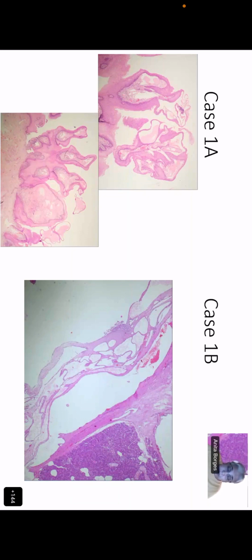So number one, a description is not about only what you see, and there are many irrelevant things that one sees. There may be spots on the slide, and there may be dust and God knows what that has been included, but surely we don't want to describe that, isn't that right?